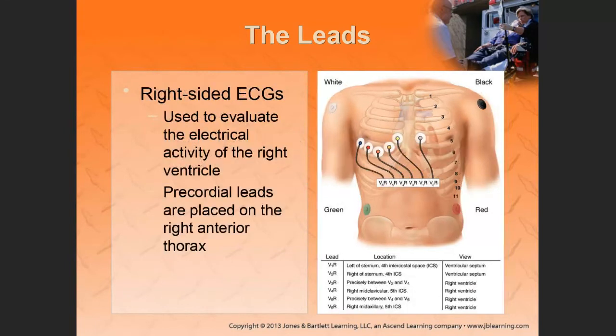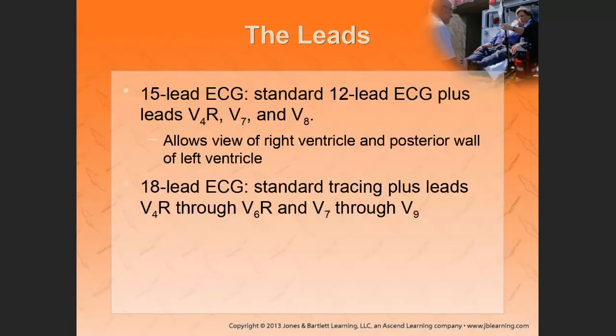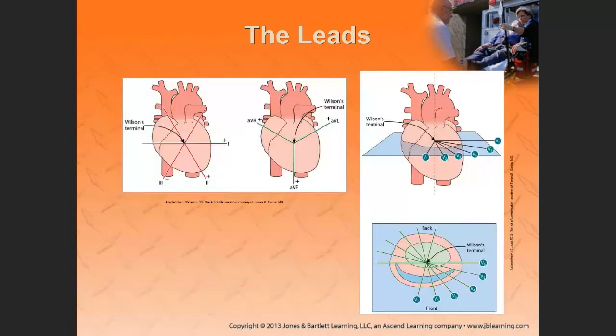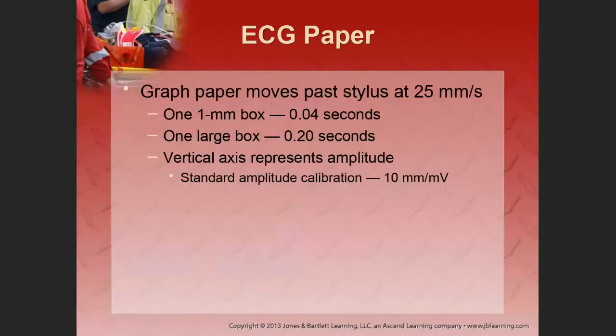Now let's look at the ECG. Now I'm going to talk about the 15 and 18 lead ECG. Don't need to know that. Let's look at the ECG paper now. All right, so learn this part. This is important.